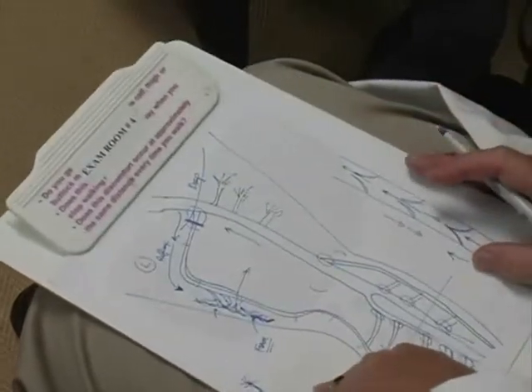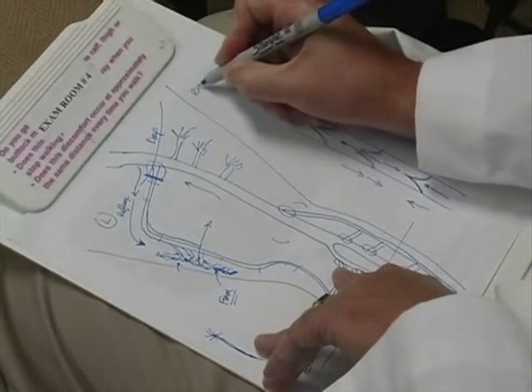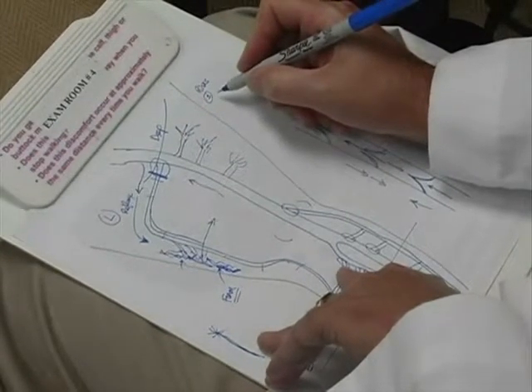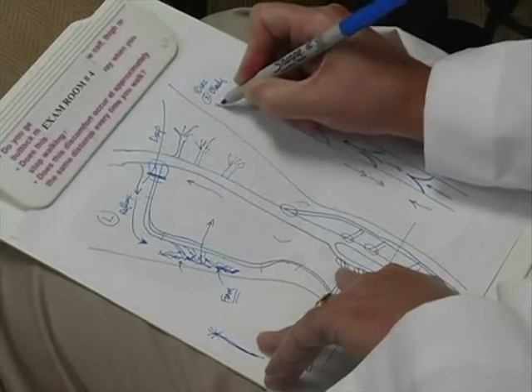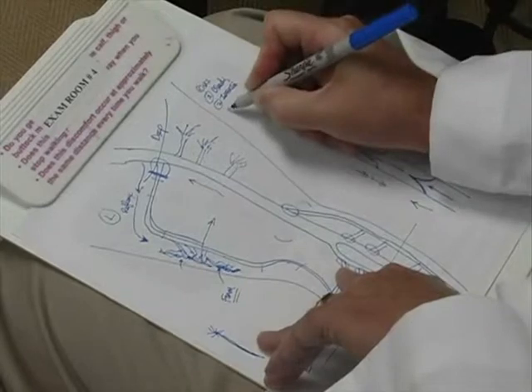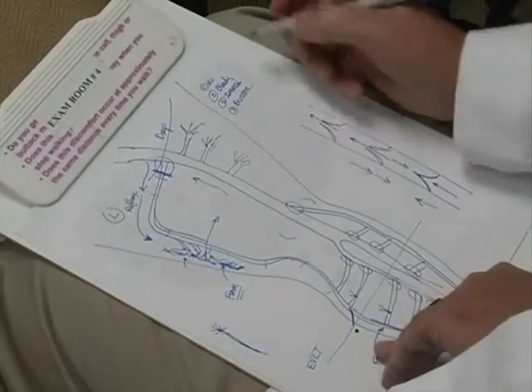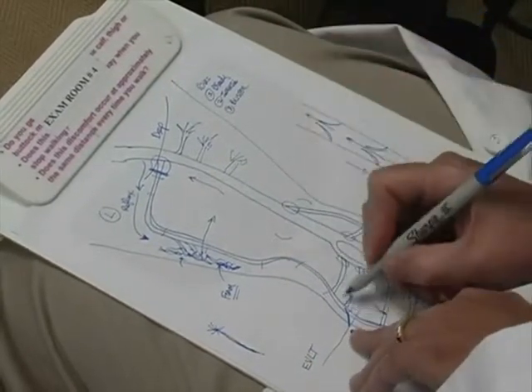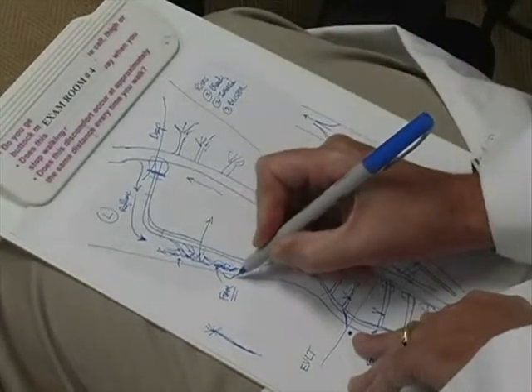Let's talk just a minute about risk. There are 3 minor risks: bleeding, infection, and blister formation. Bleeding because we puncture the skin, infection because we puncture the skin, blister mainly associated with the foam.